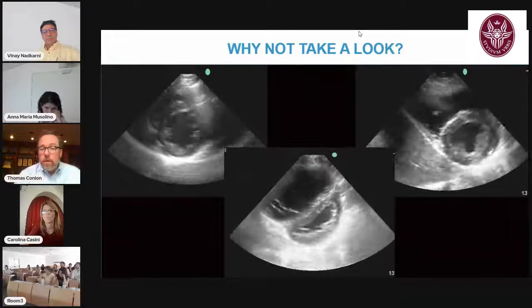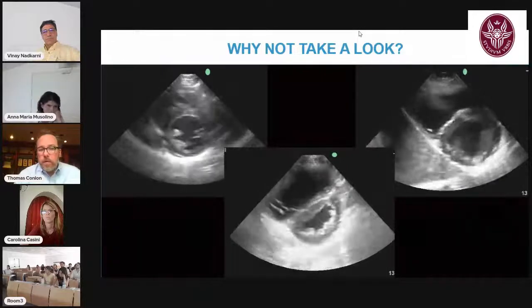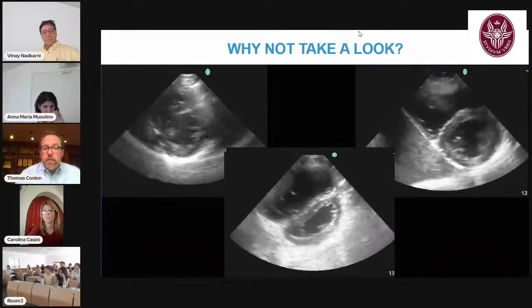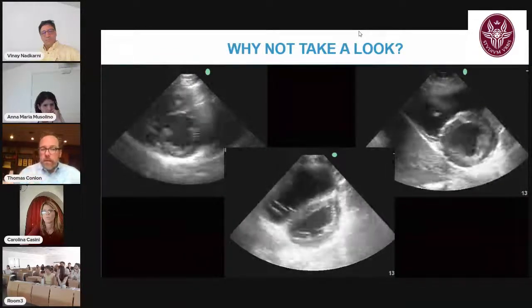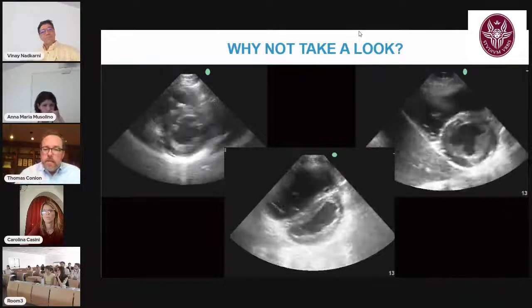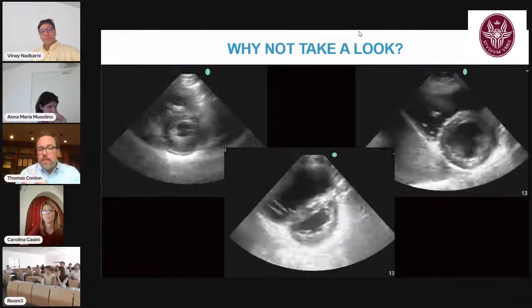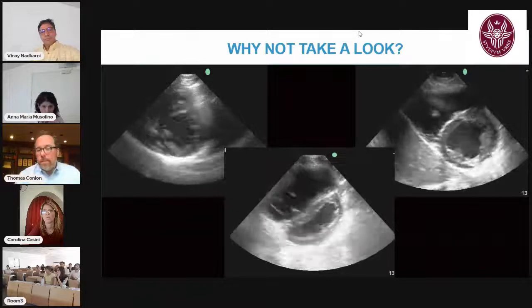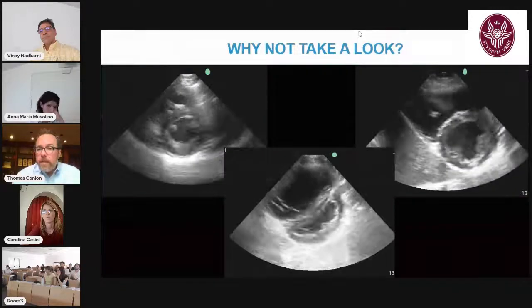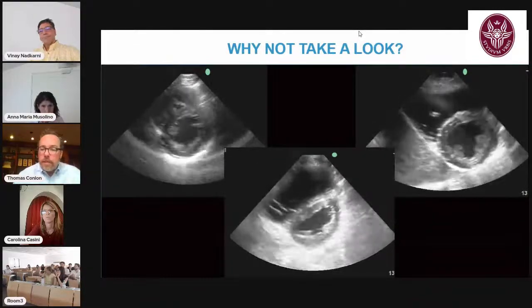Now, you don't have to be a cardiologist to see that there's a difference in these 3 patients and their parasternal short axis views. At the top left, the left ventricle, or that donut that's in the middle, looks like it's squeezing really well or hyperdynamic. In the bottom middle picture, you can see that the left ventricle is collapsed, indicating increased right ventricular pressure, or possibly pulmonary hypertension, or a pulmonary embolism. And on the right is a left ventricle that's not squeezing very well, having cardiogenic shock.